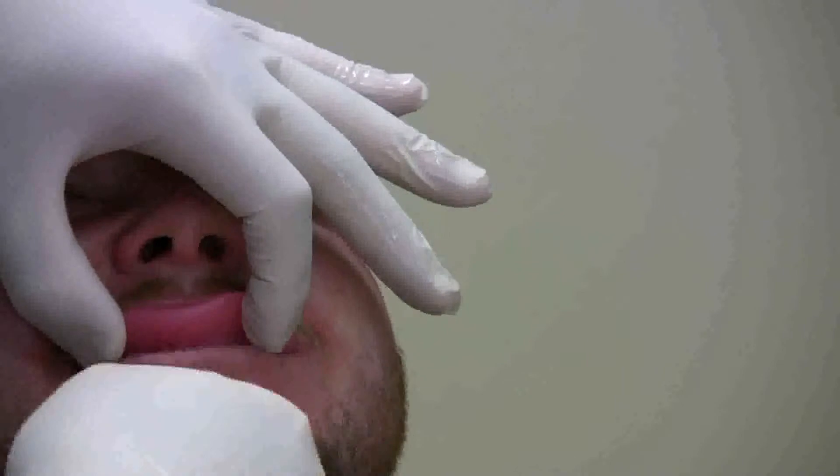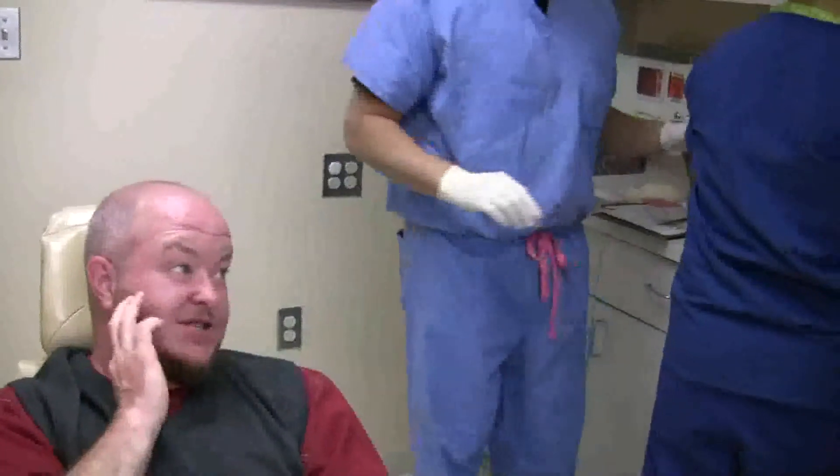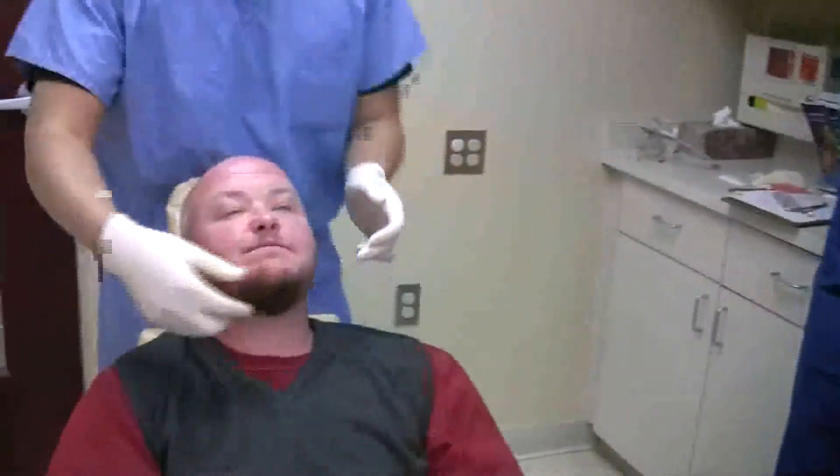Close. Open. Close. Open. Close. Open. Close. Are your teeth touching? No. They may not because it's called the centric relation position — that's when your jaw is all the way back. The right side was just snapping and clicking. That might have you close. It hurts. Sorry. That's okay.